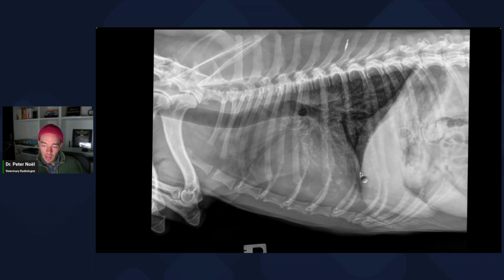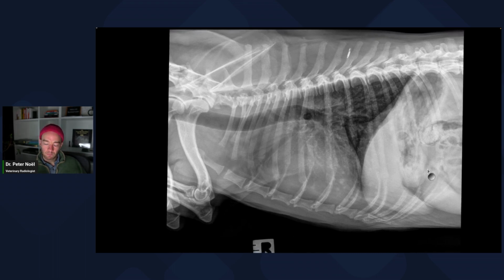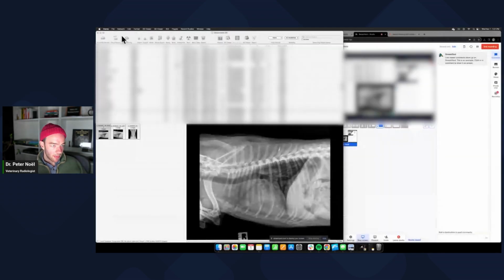The other thing I'll show you on heterotopic bone is that they tend to be uniform in size. There can be a little bit of variability, but you see in these, they're kind of different in size. This one's bigger than that one, and that one's a little smaller. So metastatic disease tends to be variable in size. And then let me pull up the heterotopic bone.